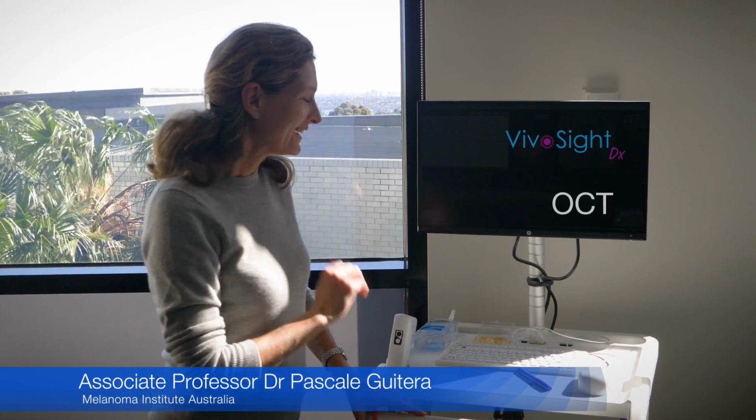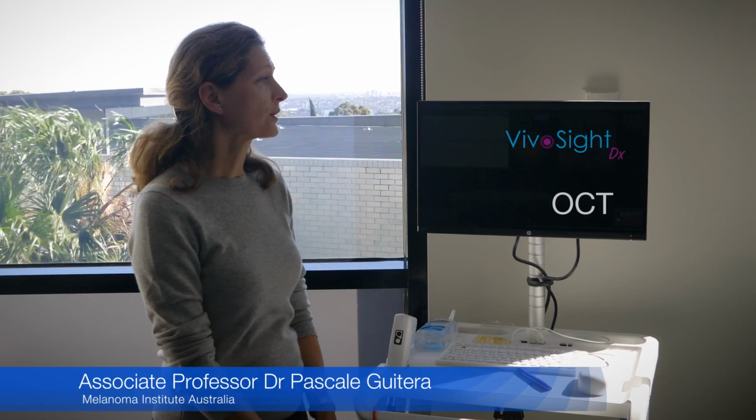How does it normally work? Do you get a certain number more patients through the door, that you see more patients generally? No, I can't see more patients. Yes, I guess, yeah. It's a question of time, going faster, and a question of confidence also. So you can do diagnosis with dermoscopy, we're not bad at that, but we're a lot more confident when we have a scan of OCT. And yes, for all the very superficial things, it just triages a little bit better. We still do biopsy and we still remove the BCC that are not superficial. So it's not like we're not doing any surgery anymore, but yeah.